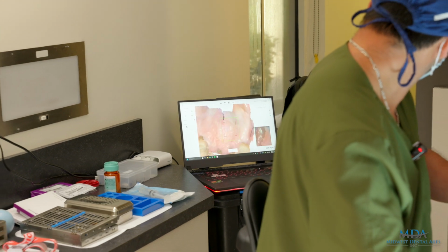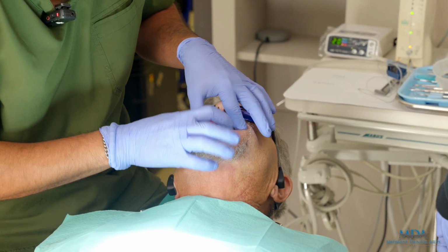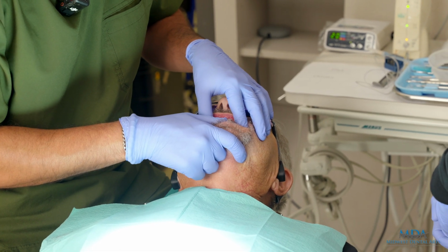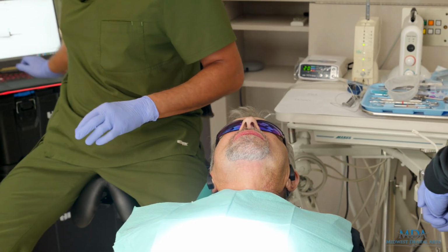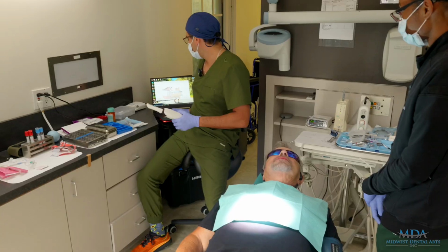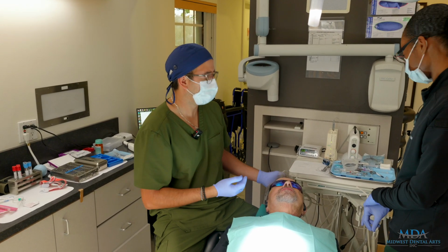Go ahead and bite down for me, sir. Relax your jaw. Bite down. Open. Relax your jaw. Bite down. Okay, stay right there, okay? Don't open. Keep it right there. Okay, so now we have all these images. We're gonna take everything off, and we're just gonna do the tissue scans, okay?